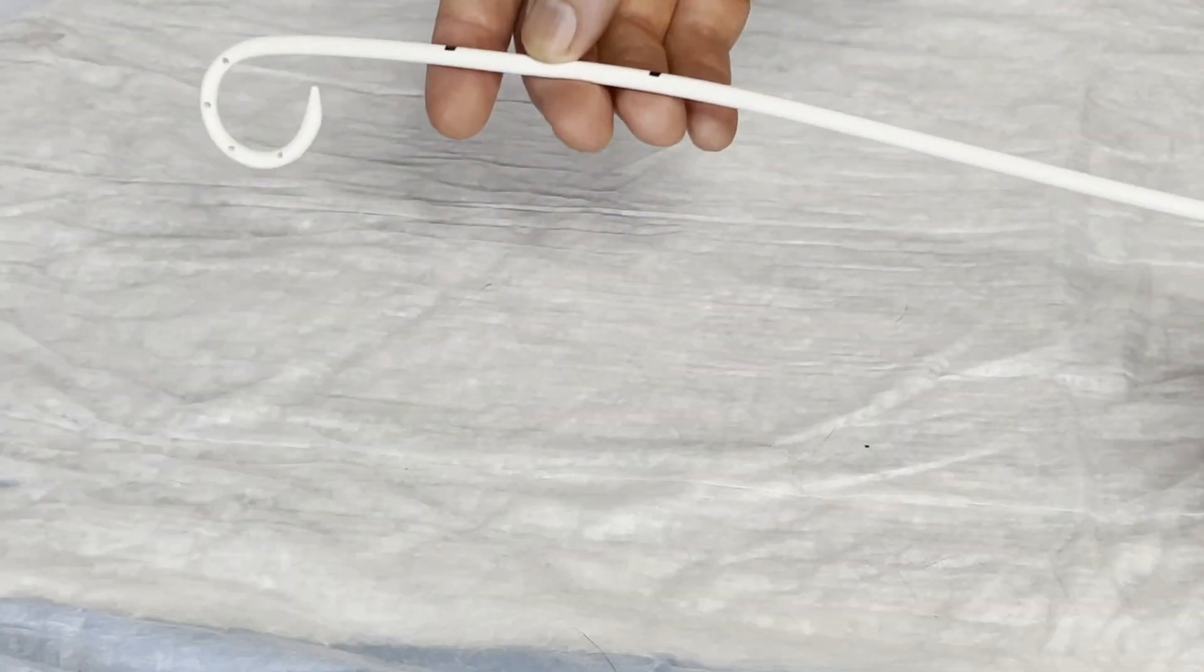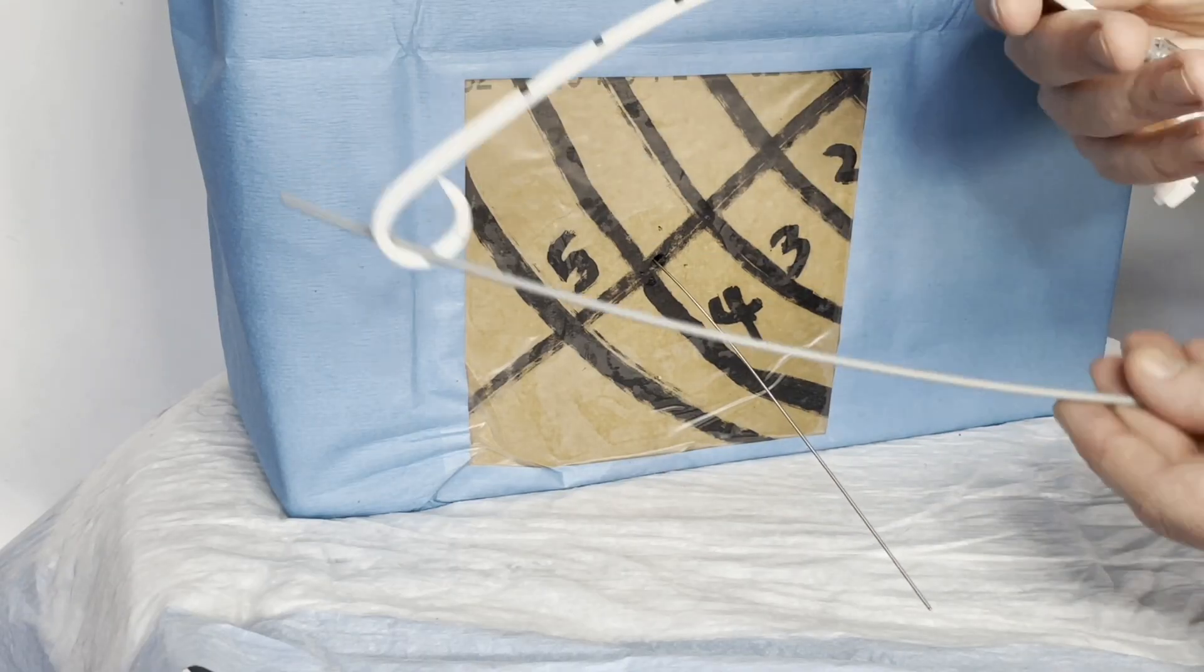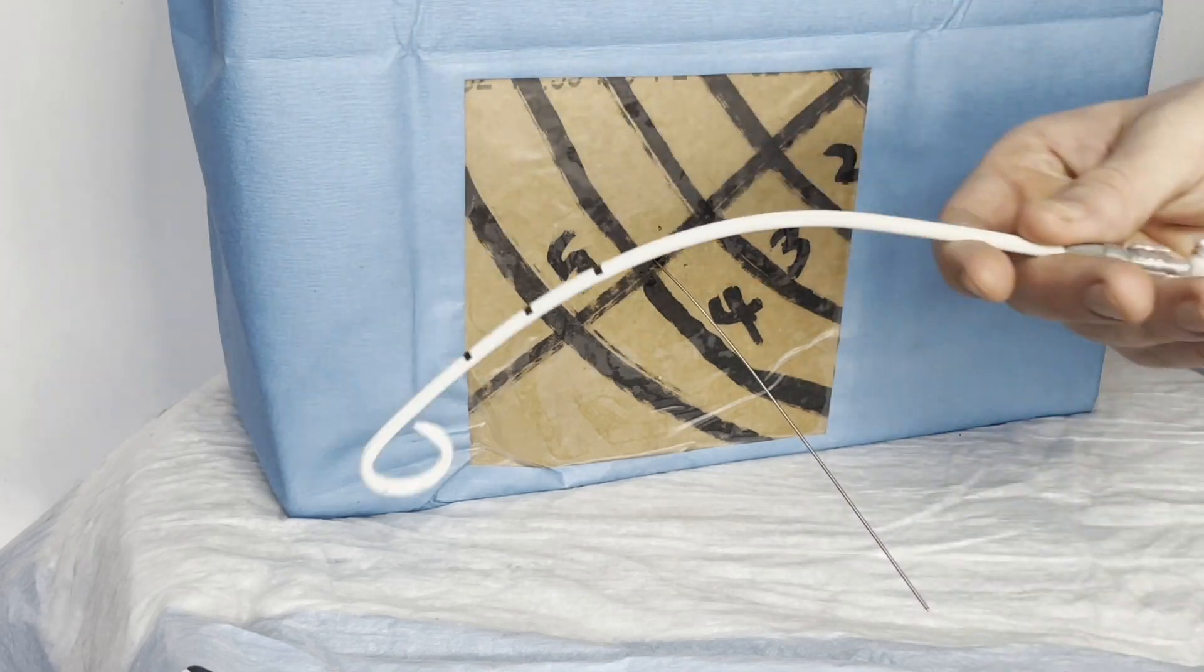And now that we've dilated our skin, we have already prepped this prior to that. So look in our last video and how we do that right off the bat. And we're ready to introduce our pigtail. Notice the curve of the pigtail and how that shapes.